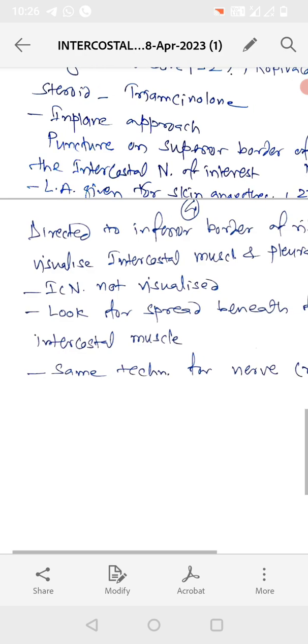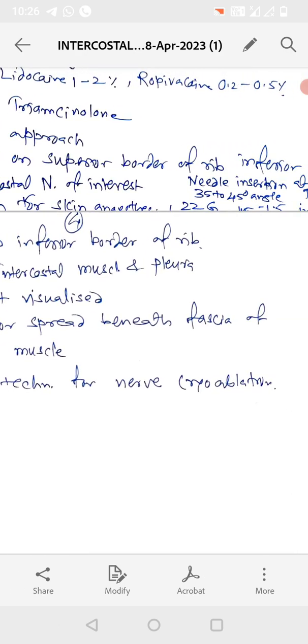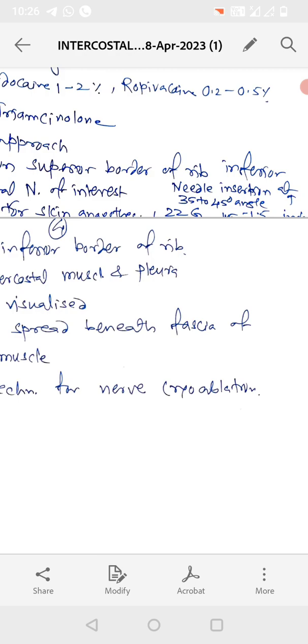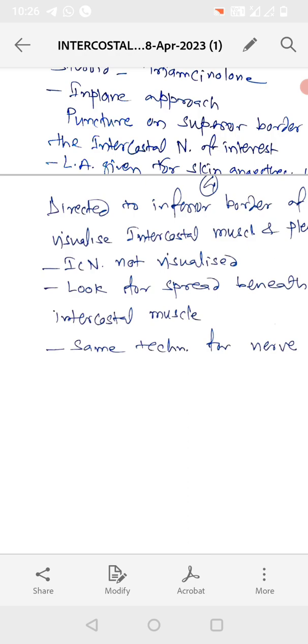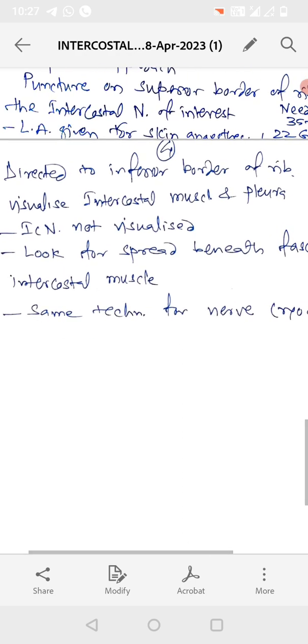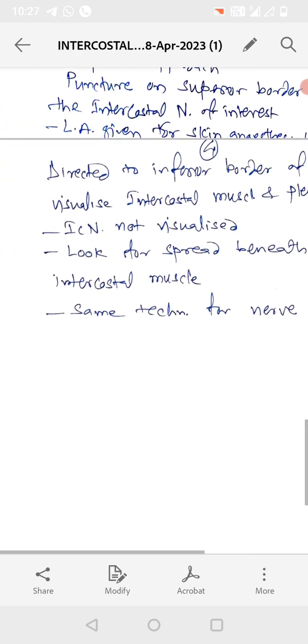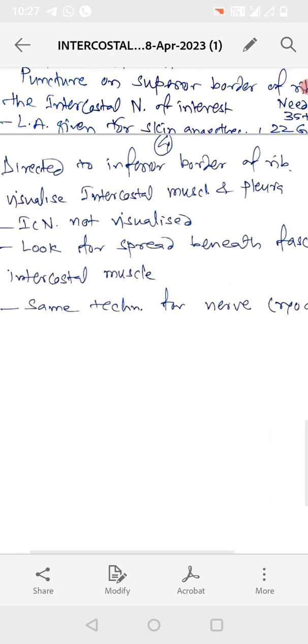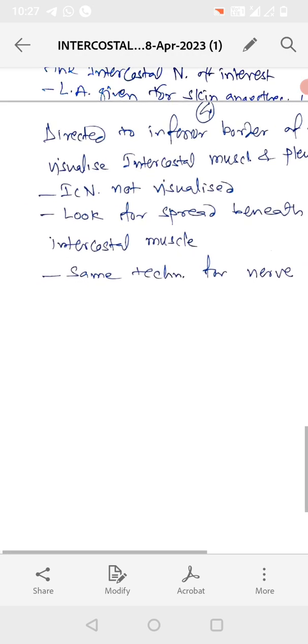Local anesthesia is given for skin anesthesia. Needle insertion is at 35 to 45 degree angle. Needle is directed to inferior border of the rib. Now visualize intercostal muscles and pleura.